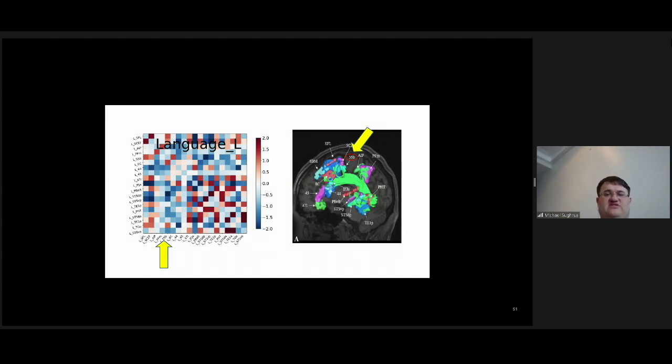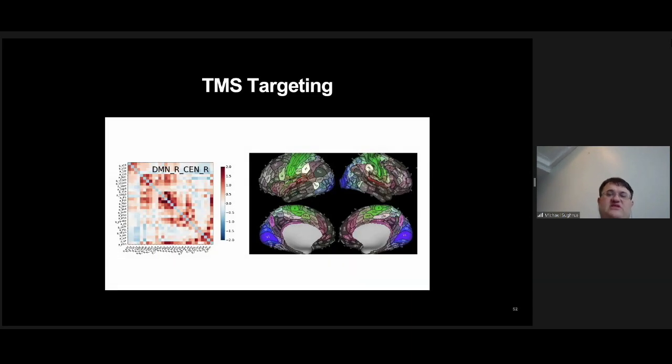So if you advance to the next slide, this means that core connectivity can be leveraged in a way that, interacting with the data, you can select a target. It can be turned into a file that's used to treat with TMS, or it could be any other thing. We as a software are relatively agnostic to how the stimulation is done. We can just point out what is not supposed to be there, or give ideas on where the abnormalities are. So next slide.